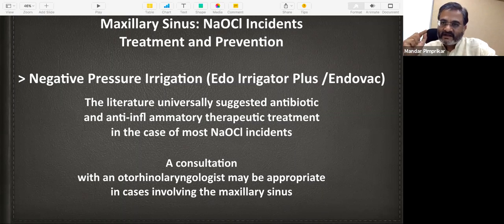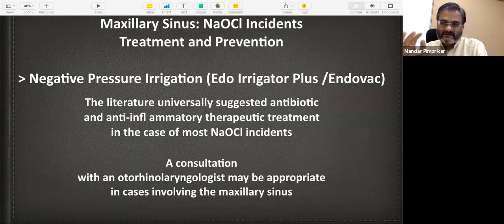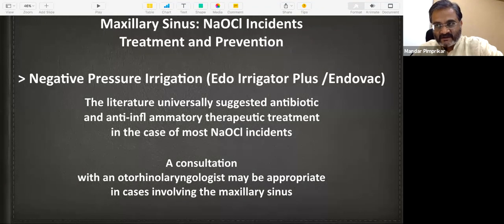Now here is one very clinically oriented tip which I want to give you. How many of you have experienced a lot of pressure while doing irrigation with 30 gauge needle? I am sure everyone must have experienced that. Even I experienced it too. So when you are doing your preparation, use a wide bore needle till middle 1/3. You got it? Use a wide bore needle till middle 1/3.